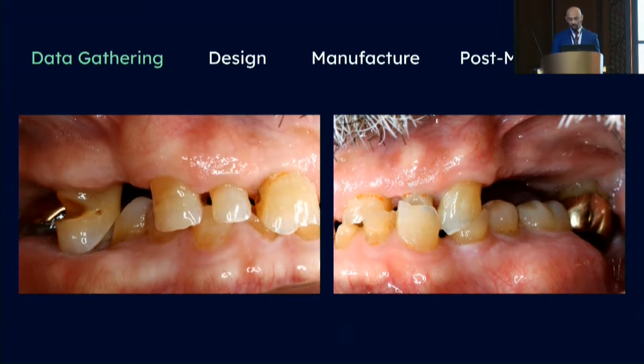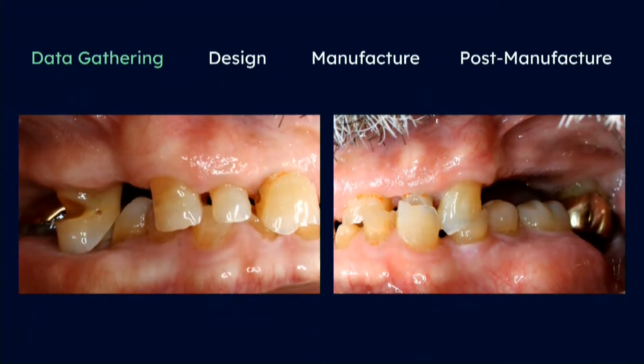The buccal images show us in more detail the amount of severe wear this patient presents with, mostly matching two-body in nature in the form of attrition, but also three-body noted on the upper right 5 due to toothpaste-toothbrush abrasion. In this maximum intercuspal position, we see that some posterior teeth have missed each other and just started walking to the other ridge, looking for someone else to live with. Sadly, there's no one to be found.